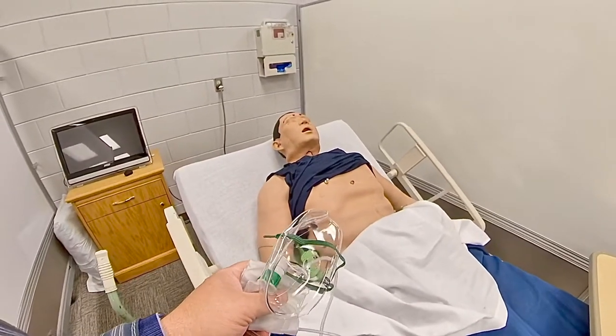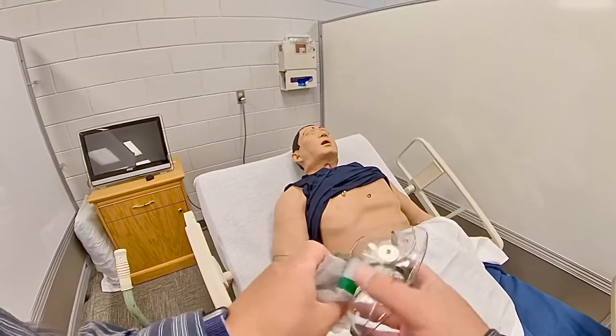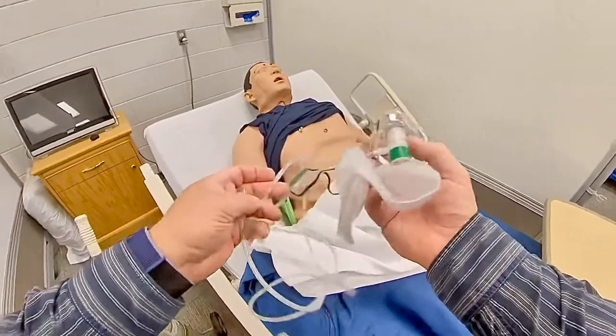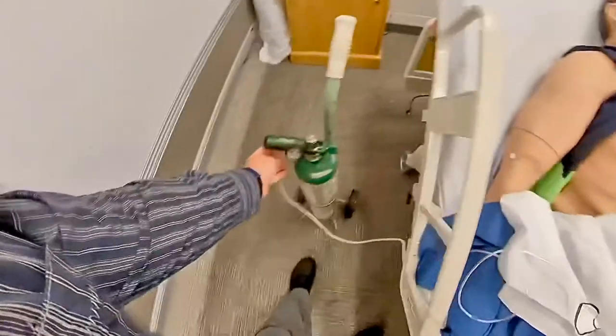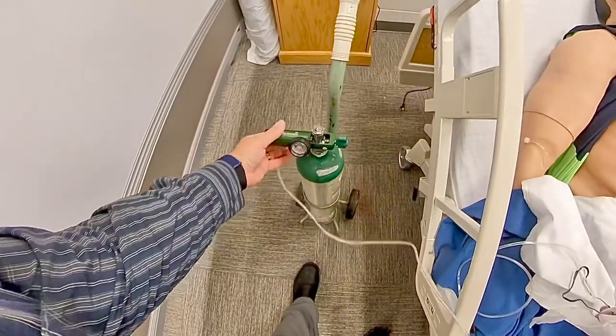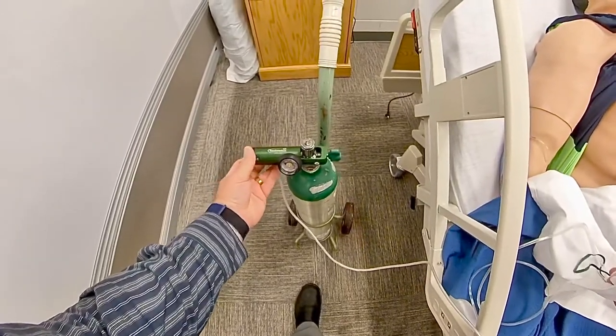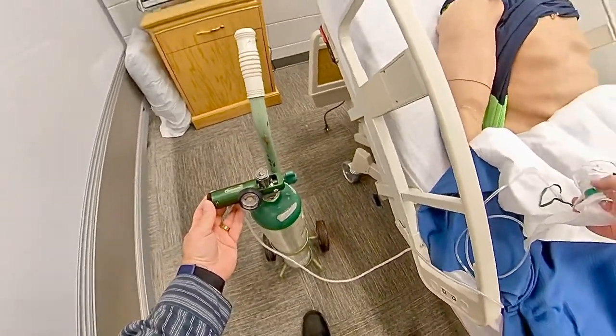I have a patient that is very short of breath and has a low pulse ox reading, so I'm going to put him on a non-rebreather mask, attach this to my oxygen cylinder, and set this at a rate of at least 10. I'm going to go ahead and bump it up to 15.